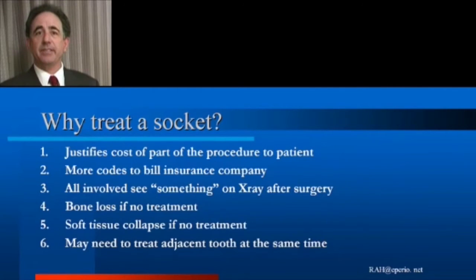If we treat an alveolar socket with a graft and/or barrier material, in addition, this justifies part of the cost of the procedure to the patient. This is yet another procedure we are performing in rebuilding the patient's entire mouth as part of their entire health process. We can see something on X-ray, but unfortunately, as we saw from one of the other patients, if you see a graft material on X-ray, often that means it has not resorbed and will remain clinically and radiographically over time.